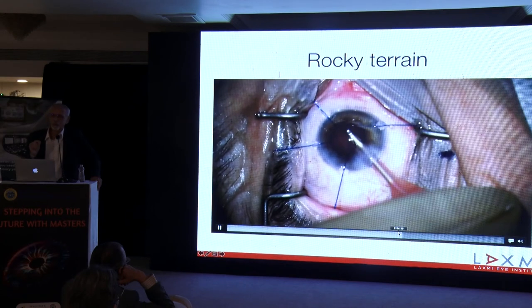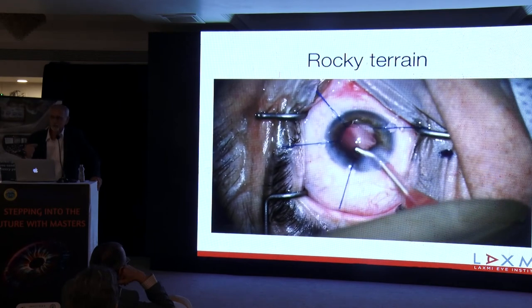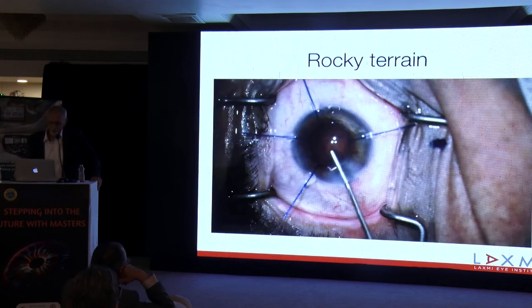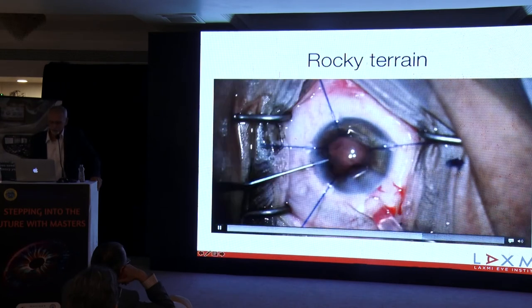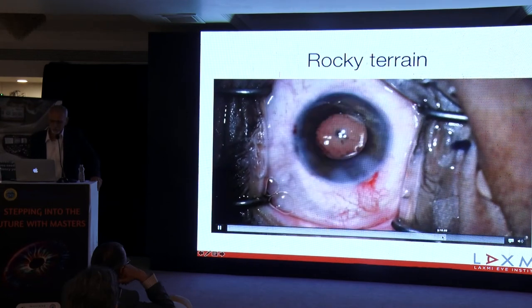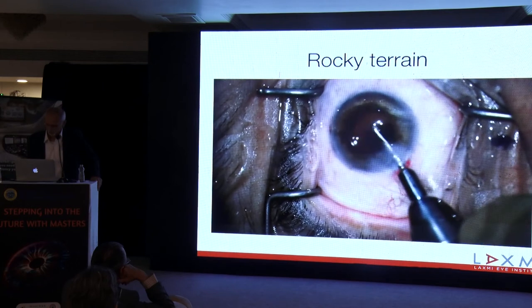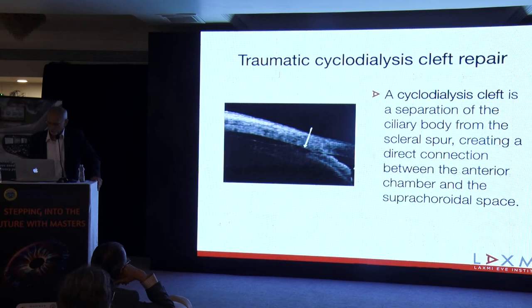But very often when it comes to putting in your endocapsular ring a little before, if by your ill luck the epinuclear sheet stays behind the endocapsular ring, to get it out is sometimes a challenge. And this is how you can use the forceps to just pull it out. So this is a very nice tool.